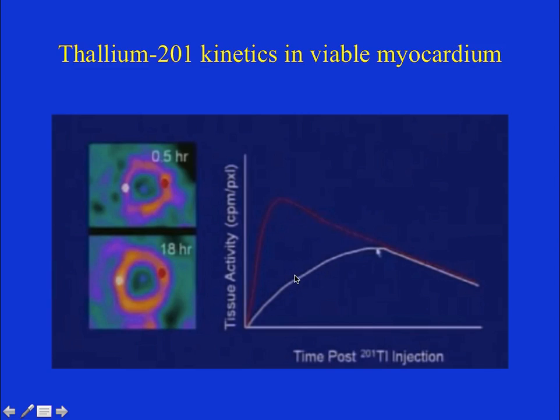This is how a viable myocardium looks in a thallium rest redistribution study, because we do the test at rest and the redistribution study as delayed rest. We call it a rest redistribution study. This viable myocardium shows uptake which was initially photopenic. If this myocardium were actually scar, then there would not be any improvement. This is how viability assessment is done by thallium.